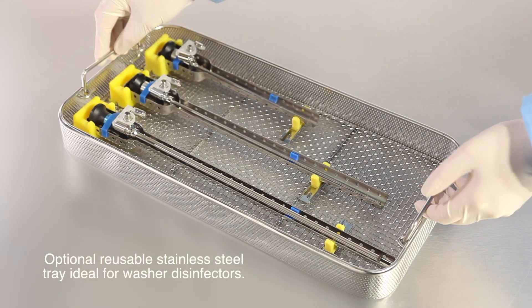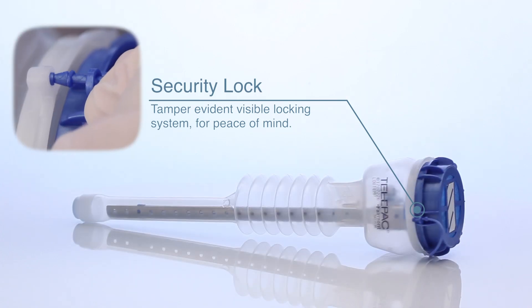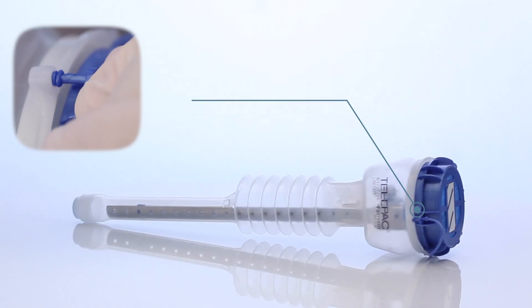Optional reusable stainless steel tray is ideal for washer disinfectors. Security lock provides a tamper-evident visible locking system for peace of mind.